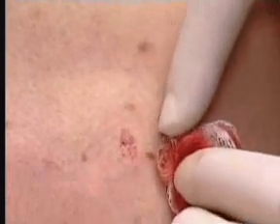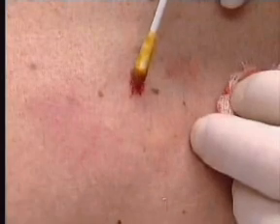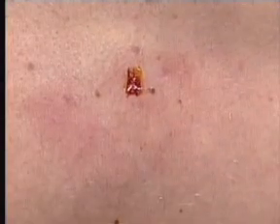The nice thing about this technique is that the incision is very superficial. The scarring should be quite minimal and very acceptable from a cosmetic point of view. Use Monsell's solution to stop the bleeding, which should occur in just a few seconds. Monsell's solution is not used on the face because sometimes iron staining can occur. Finish by applying a bandage.